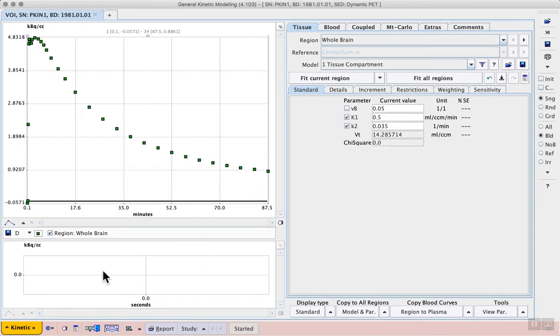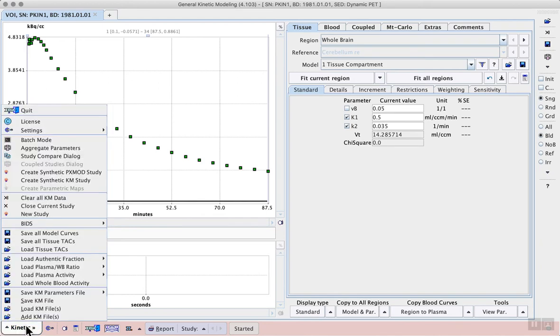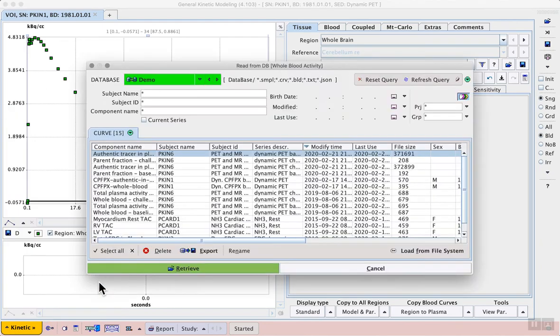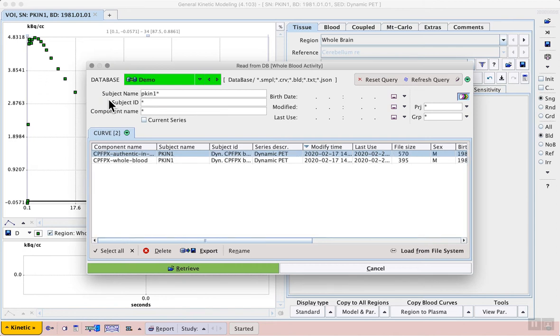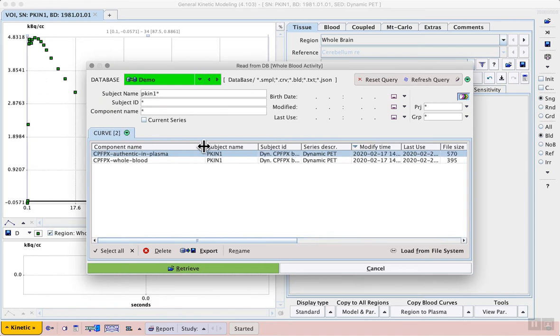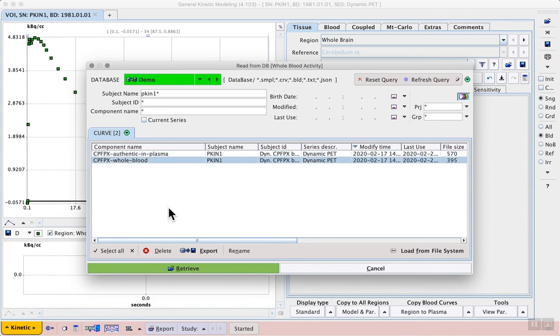From the kinetic menu in the lower left we can load the whole blood activity. In there is the dialogue for blood data. We can search specifically for the PIKIN1 example and we can select the CPFPX whole blood.